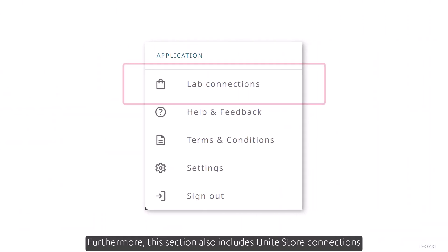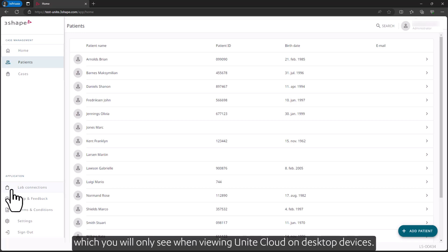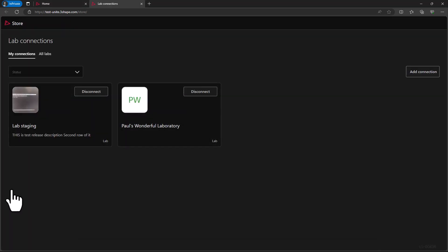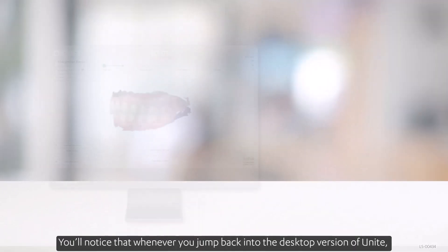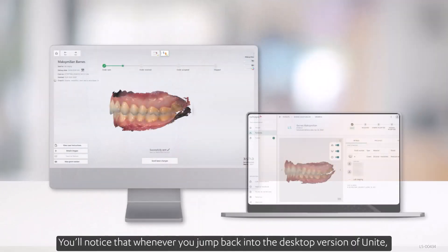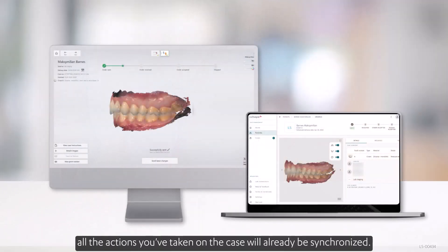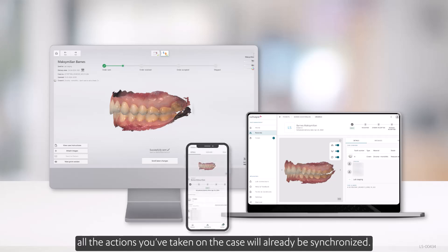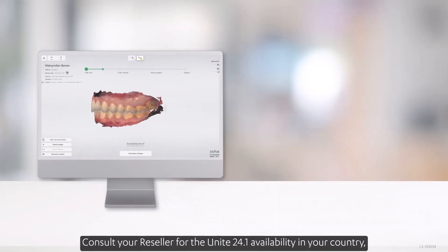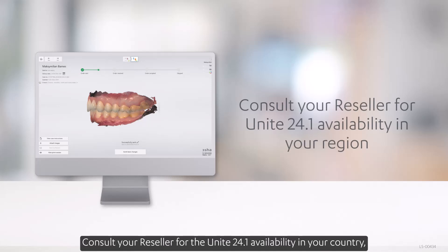Furthermore, this section also includes Unite Store Connections, which you'll only see when viewing Unite Cloud on desktop devices. You'll notice that whenever you jump back into the desktop version of Unite, all the actions you've taken on the case will already be synchronized. Consult your reseller for Unite 24.1 availability in your country to fully benefit from Unite Cloud.